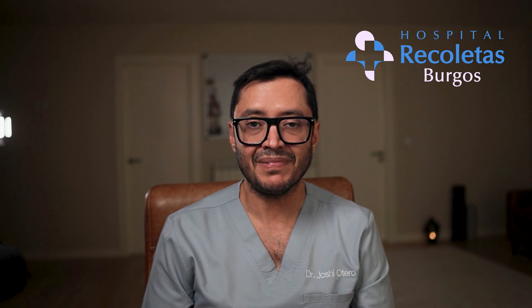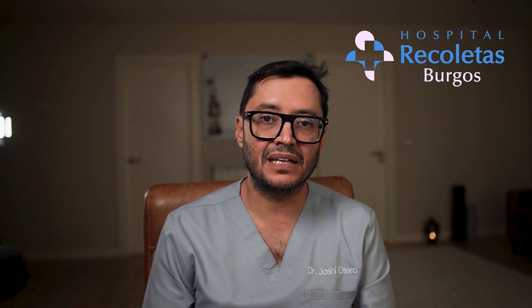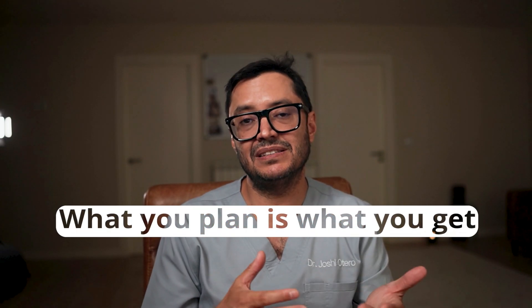This is the X-Guide navigator from Nobel BioCare. I wanted to show you the advantages of doing navigated surgery even in a single and straightforward implant. You will see that the setting of the navigator may take a few extra minutes, but in the end the process is very rewarding. When I do freehand surgery for implants, sometimes I find myself thinking after surgery whether the implant was maybe two millimeters farther than planned or the angle was not the best. With the X-Guide, I feel that what you plan is what you get, at least to a certain extent.